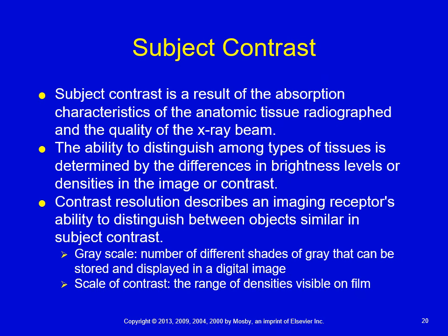Bones are going to absorb more of our X-rays, while air-filled organs are going to allow more of the X-rays to pass through. Now, those different absorption capabilities, the differential absorption that we talked about earlier, is what allows those tissues to show up differently on the X-ray image.